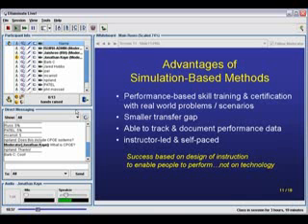We want to be able to document that and track what people are doing so we can see how they improve and make corrections as necessary. Simulations can be either self-paced, kind of like what you saw before, or instructor-led, where I'm in front of a class and each person has access to the infusion pump or the ventilator or whatever.